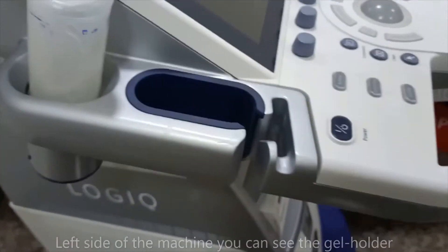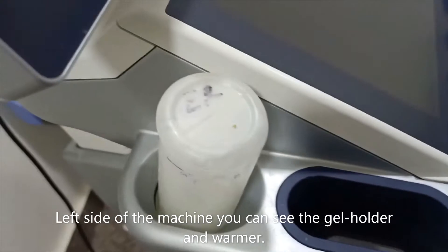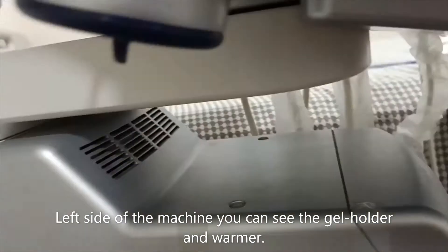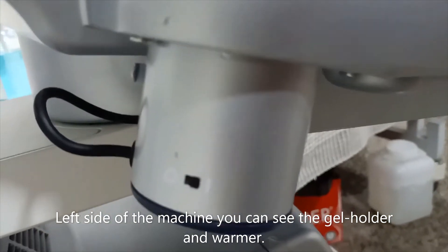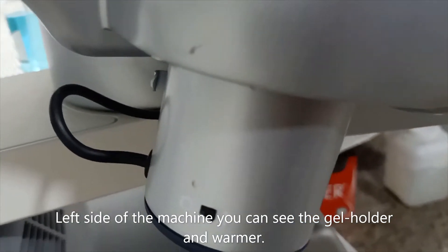In this machine, four ports are available and we have connected three: the cardiac, linear, and convex probes. On the left side of the machine you can see the gel holder. You can clean it, and this is the on/off switch for the gel holder.